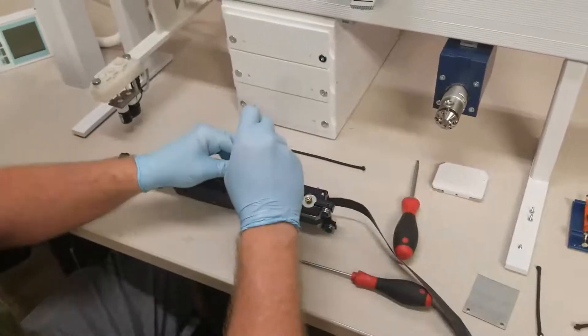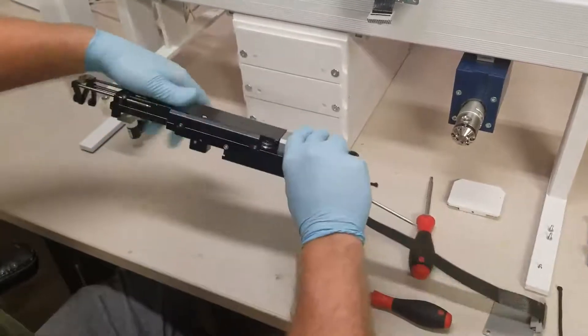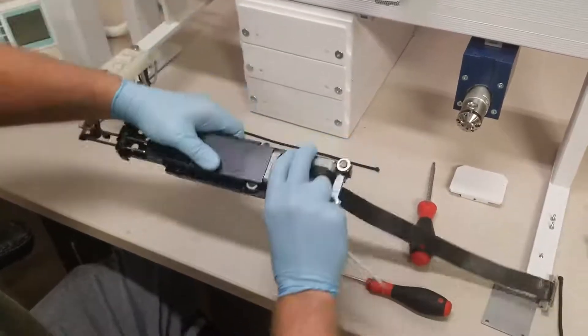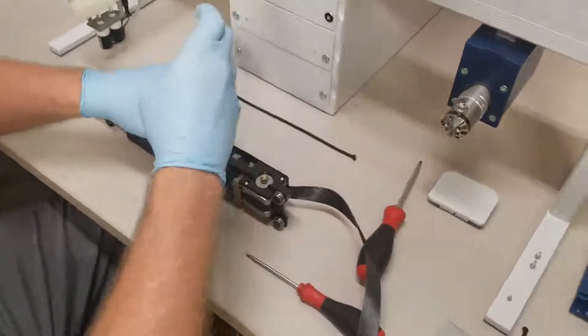Now, using a Torx 8 driver, we will remove the five screws that are holding this back cover in place. These also have small lock washers that you want to be careful not to misplace.